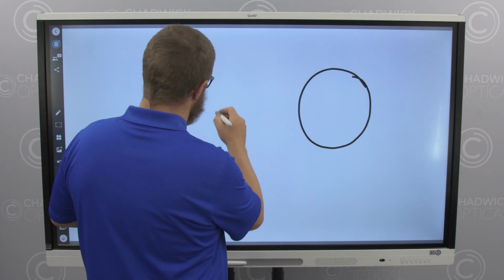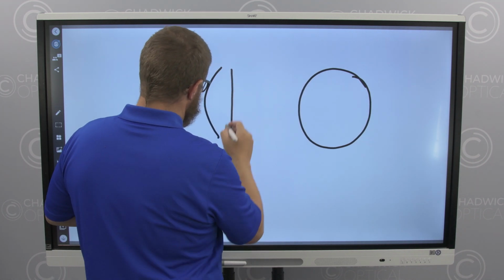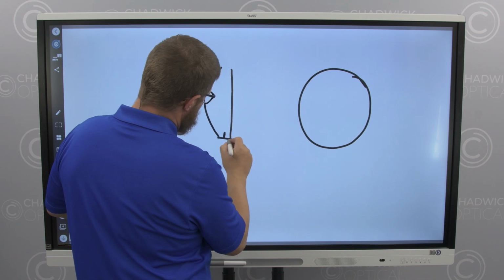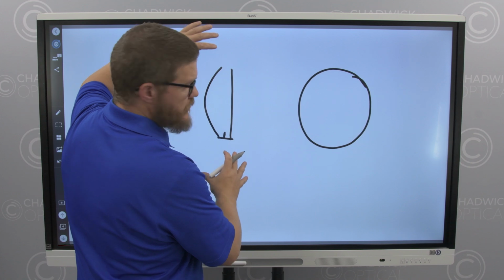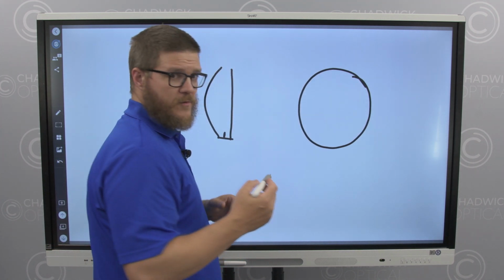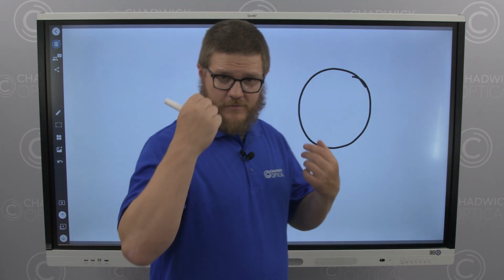When we make a nylon rimless lens, we have to make it thicker so that we can put a groove in the lens that the nylon sits in. To make the lens thick enough to accommodate that groove, we need to make the entire lens thicker.